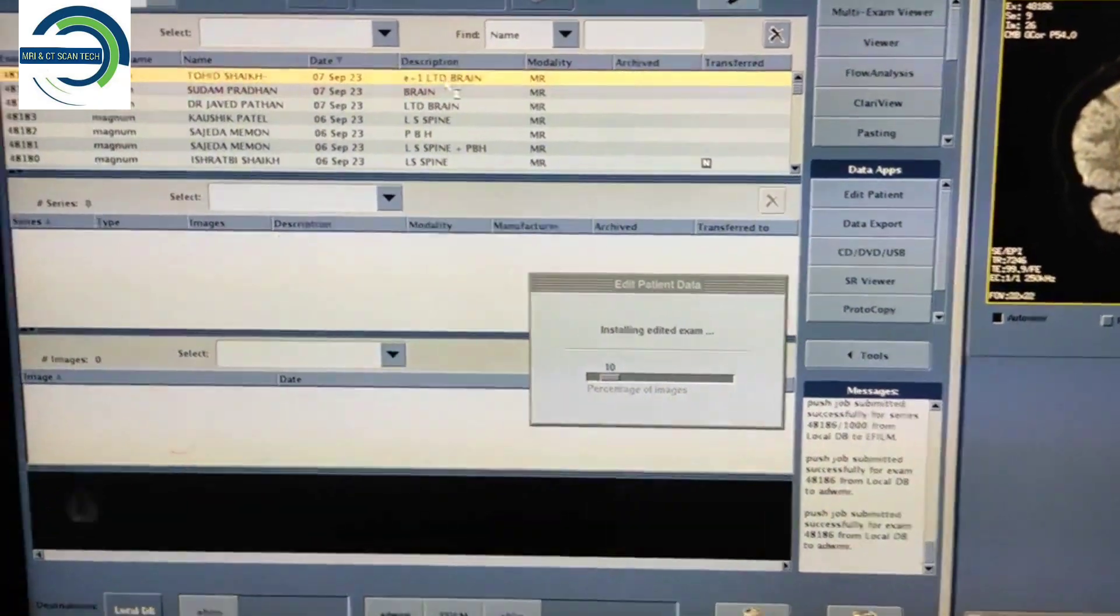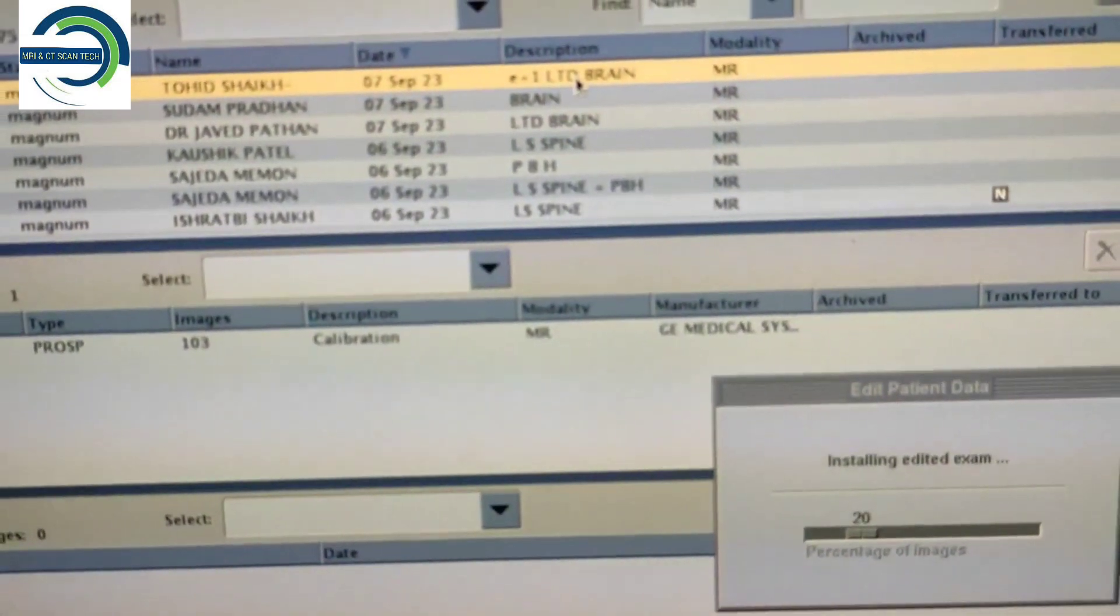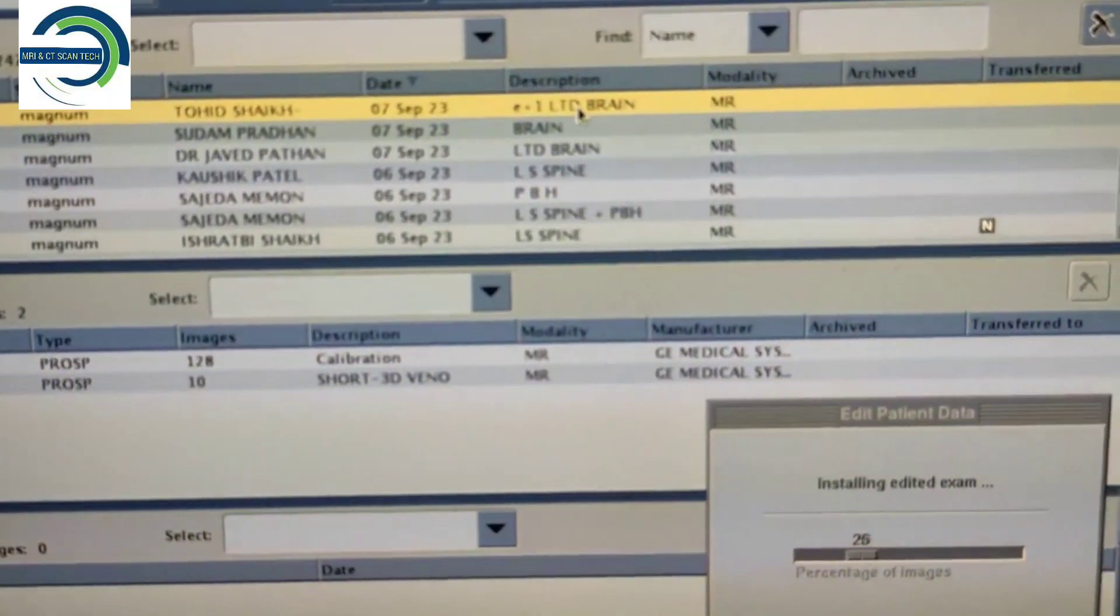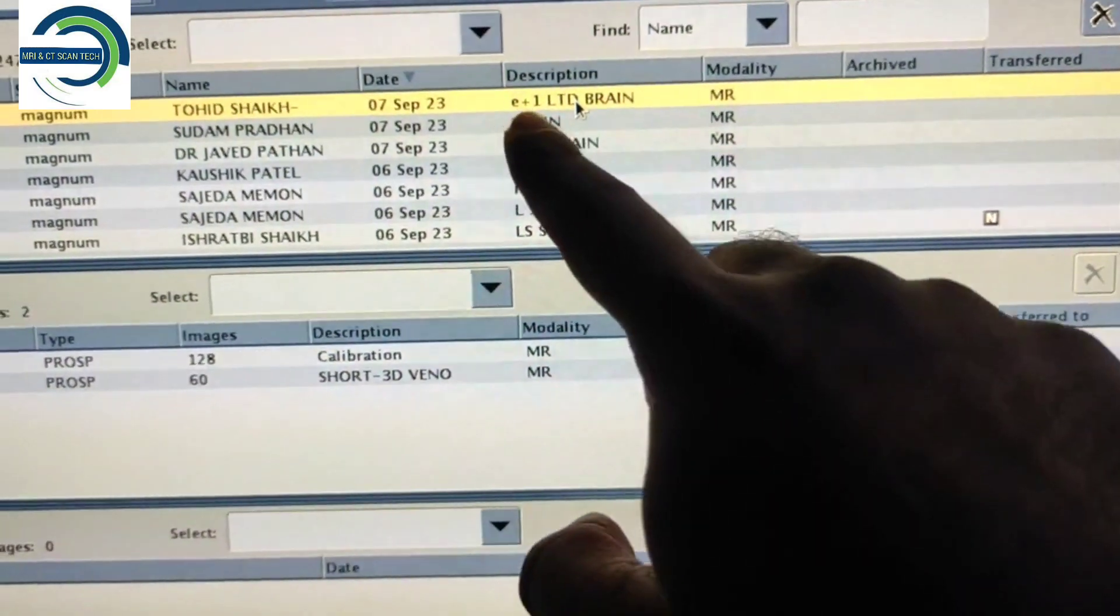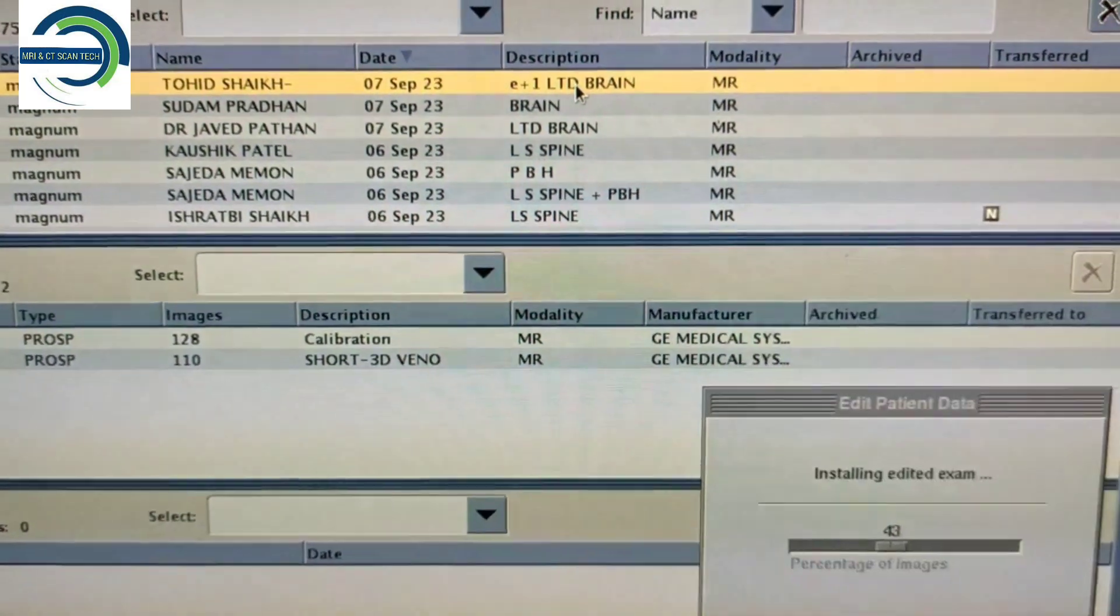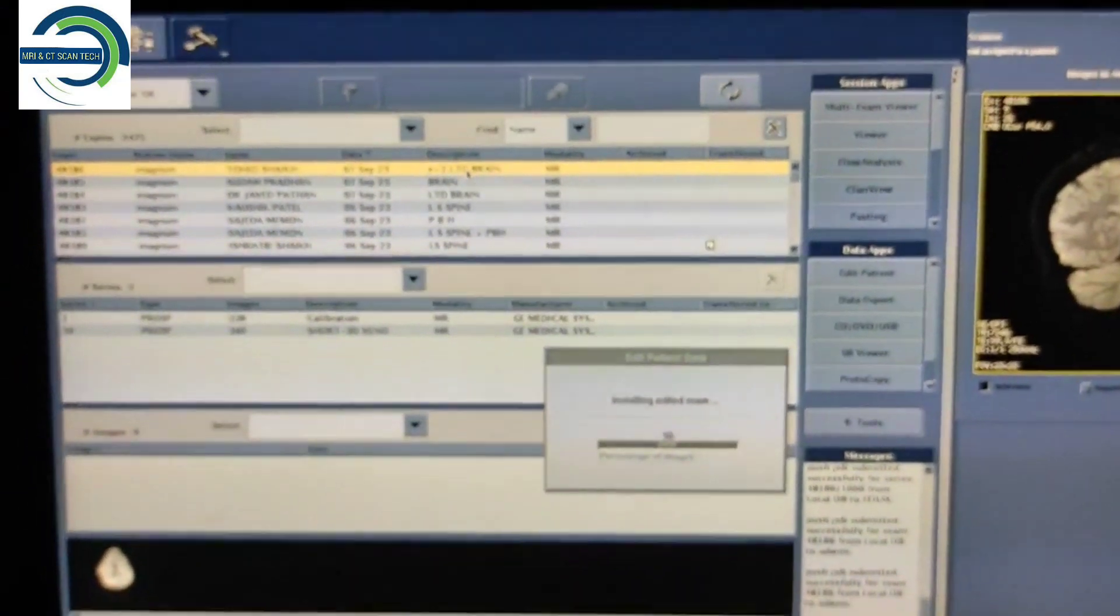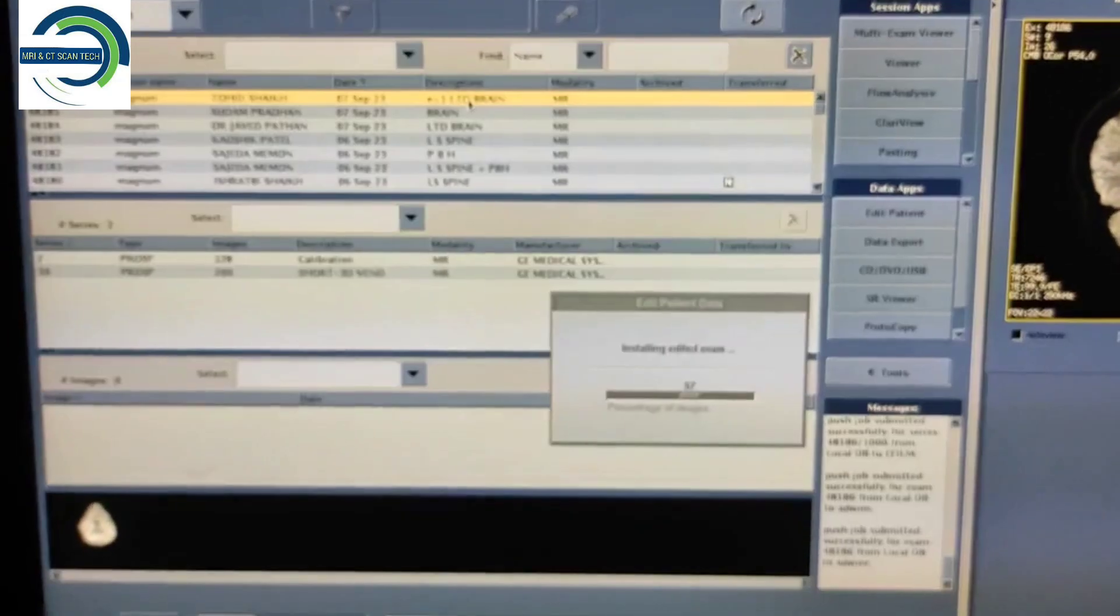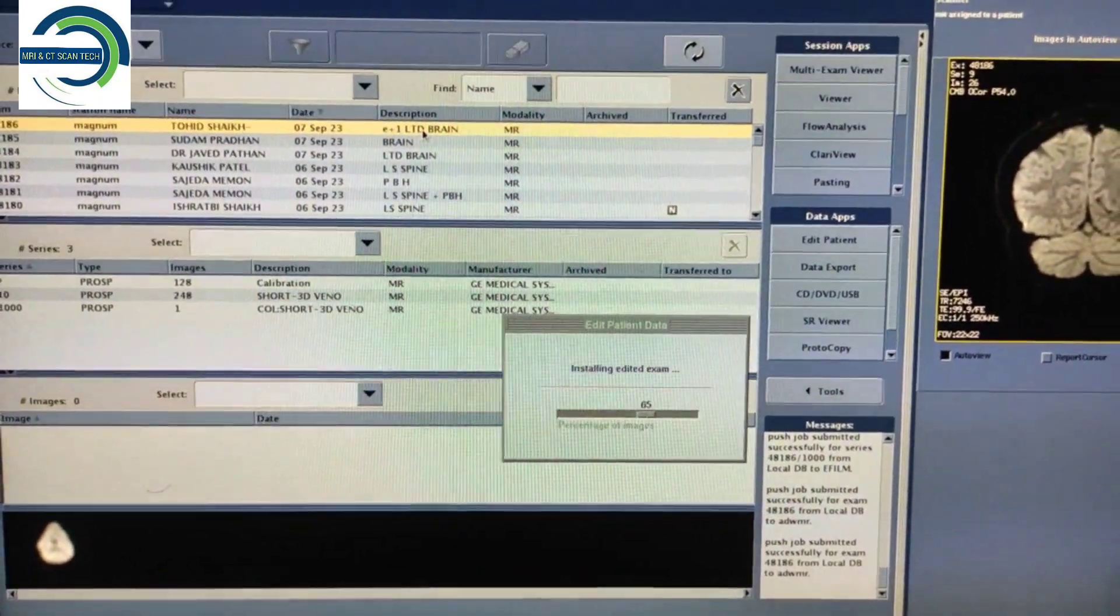So now you can see over here the patient name is coming written with E. You can see E means edited patient name. So this is how you have to edit the patient name on this GE system.